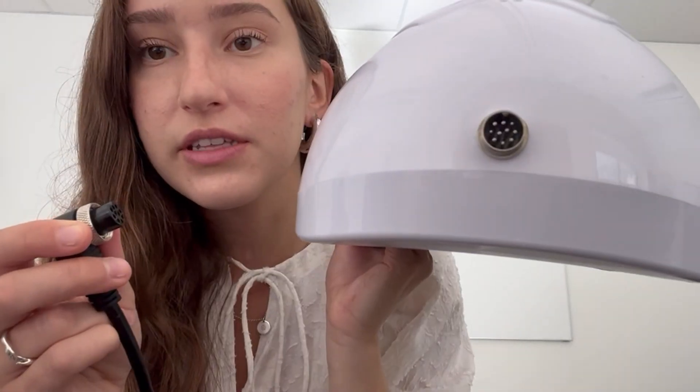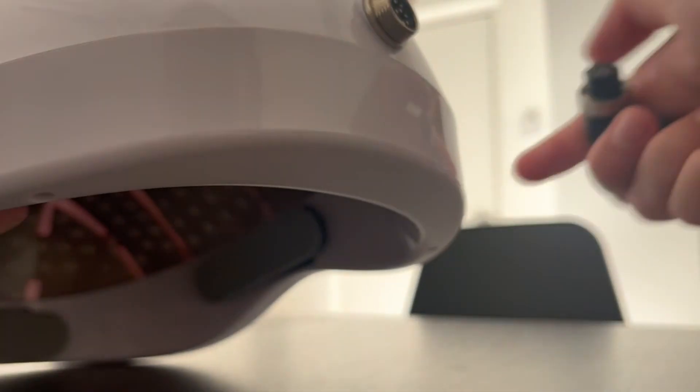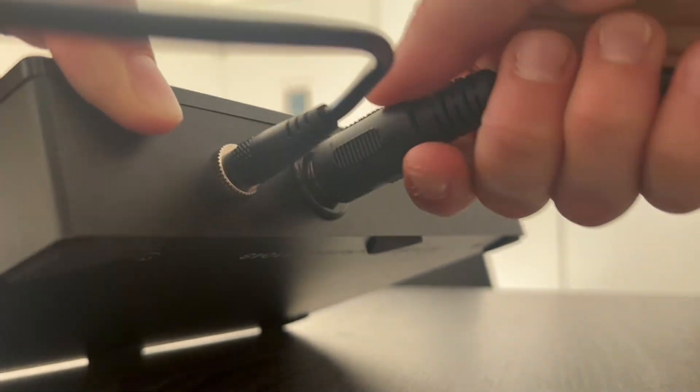Then you have your final black cord with the two similar-looking ends. The end with the little spinny top is going to go into the back of your helmet right here — see how there are pins and holes. You want to make sure that they're aligned and snug and tight. It should go like this, and then you can screw it on to make sure it's tight. Then take the other end and plug that into your controller, ensuring the same snugness and tightness. Take this time to double check all your connections and make sure they are super snug and tight.